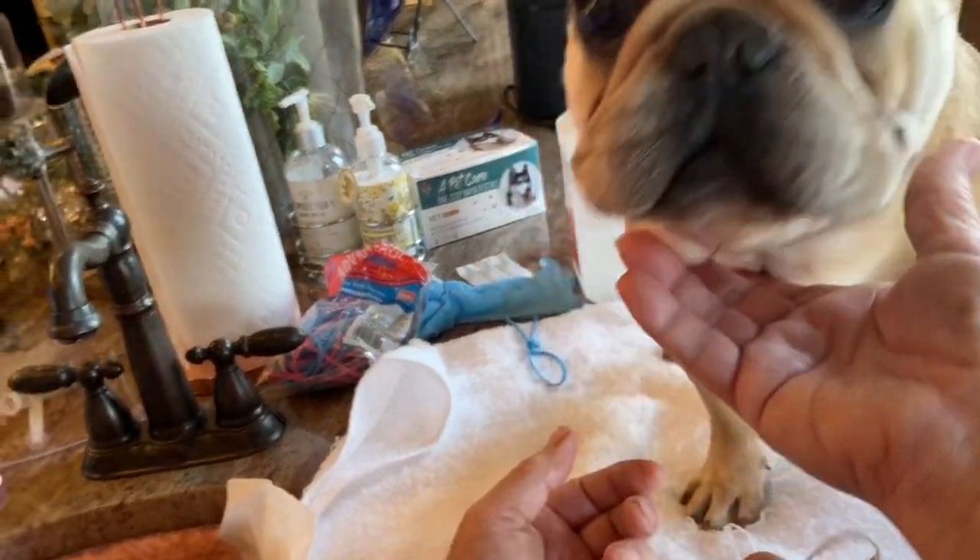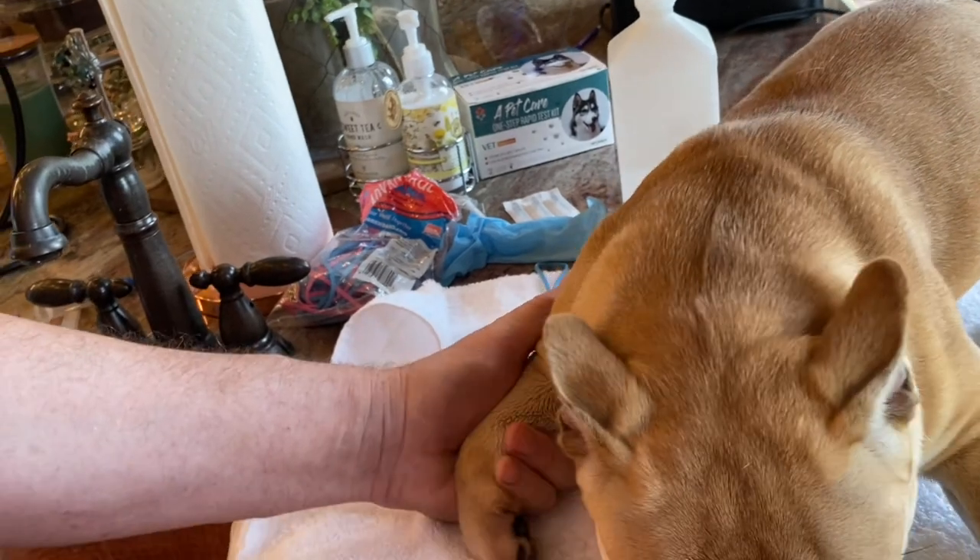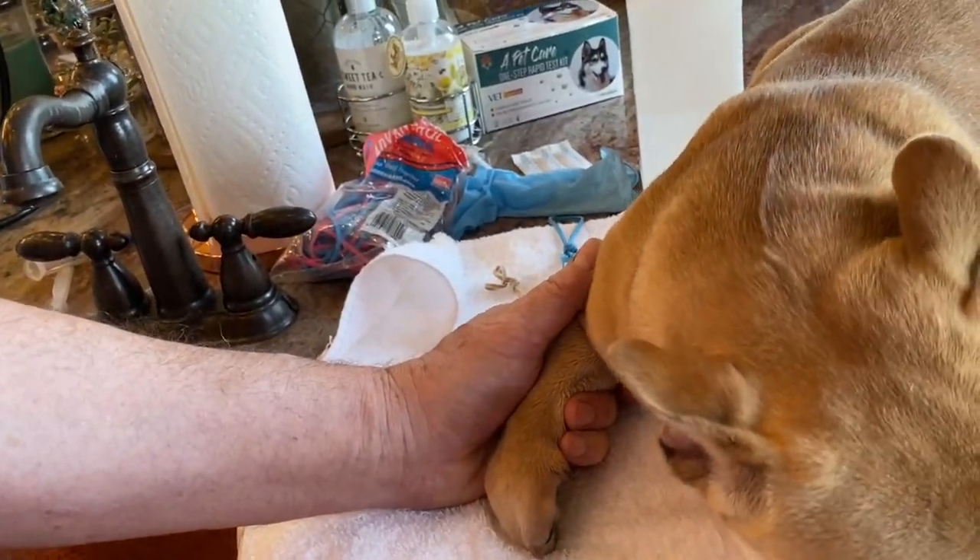And it's free — you can throw that away. You don't have to go buy a $50 tourniquet. It's a one-handed operation, which the other ones are not. It's just such a simple way of doing it. That's all I wanted to show you. That's a little tip from mybritishsupply.com. Be nice to your doggies. Bye everybody.